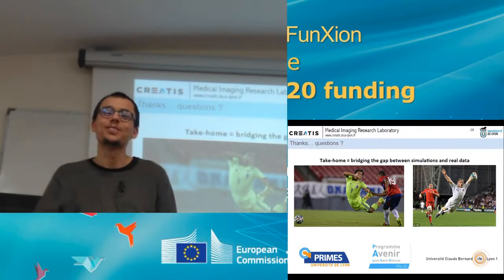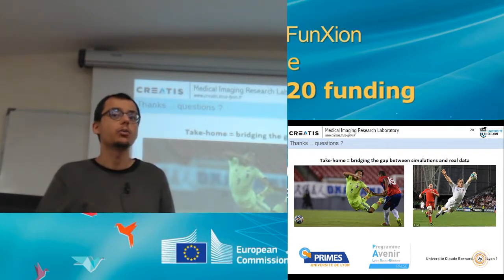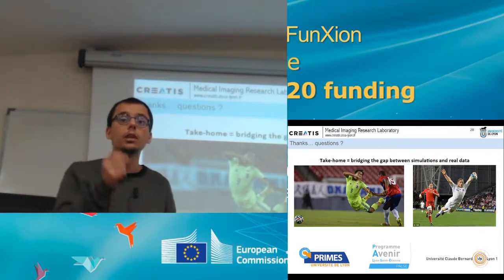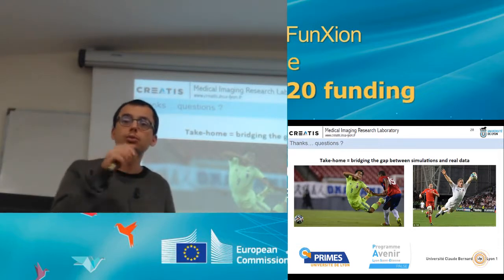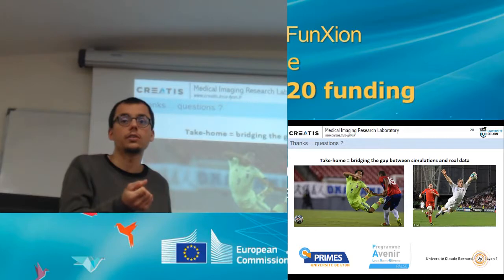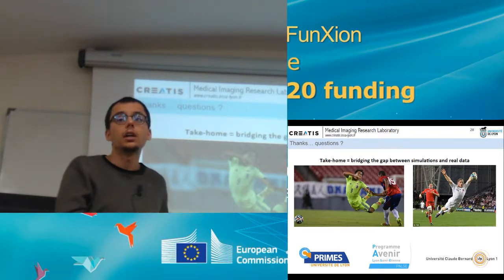I would say, for example on segmentation, yes, there are millions of parameters, but the quality is very high for the moment, with respect to what we had before. And the purpose is still to keep a manual interaction, so that the radiologists won't have to segment easy cases. They will be pre-segmented, but they still have the hand for the challenging cases. So behind this, obviously, there is the strong idea of being able to say this one is badly done, and then leave the hand to the cardiologist for that moment.